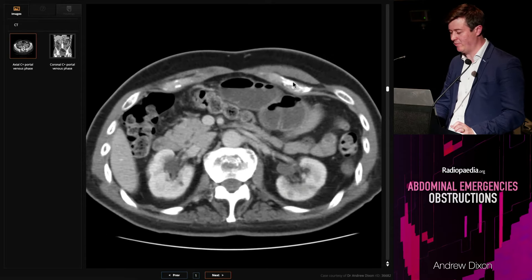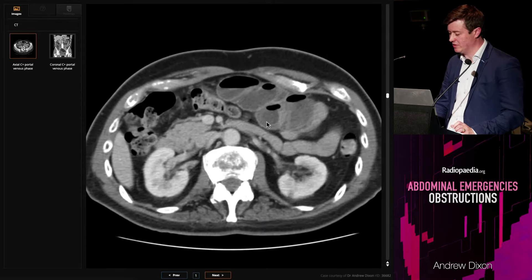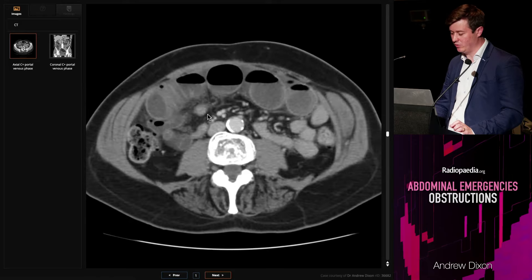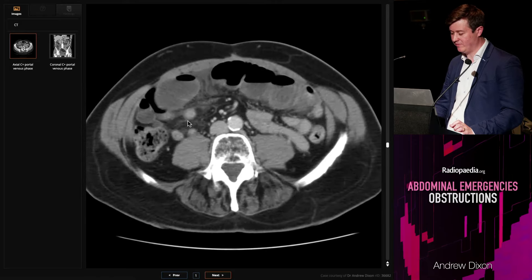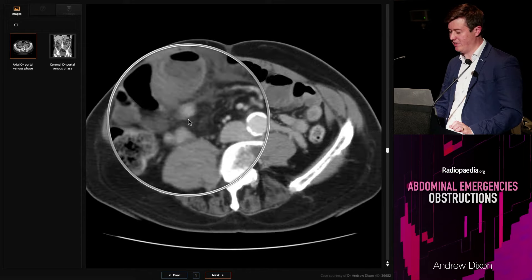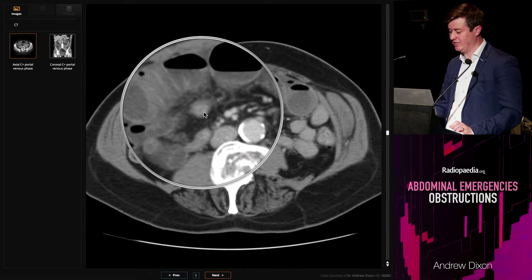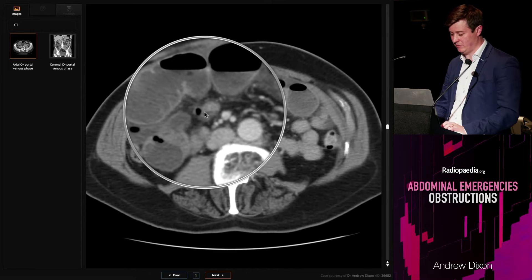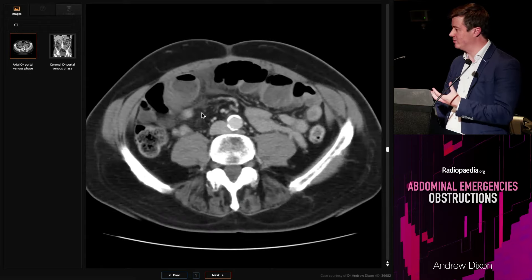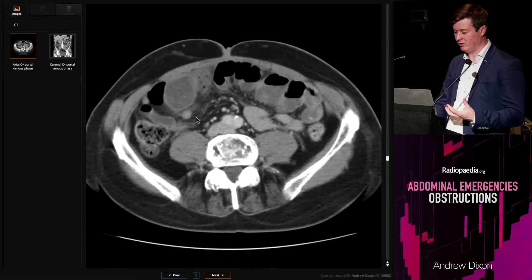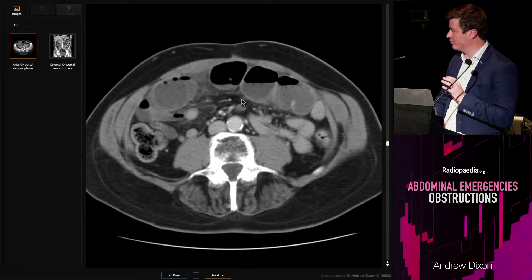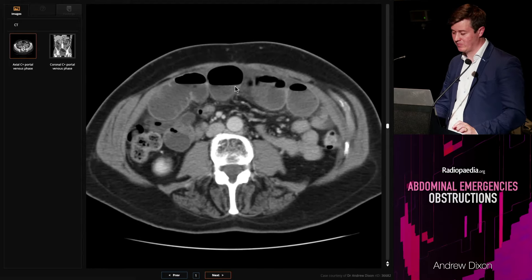This is really up in the left upper quadrant — you've got distended loops there. If we come down to the right iliac fossa, we've actually got some collapsed bowel down here. See that loop? Completely collapsed down. So we've found loops of bowel that are distended proximally and loops that completely collapse distally. We're thinking there's probably a transition point — let's try and find it.